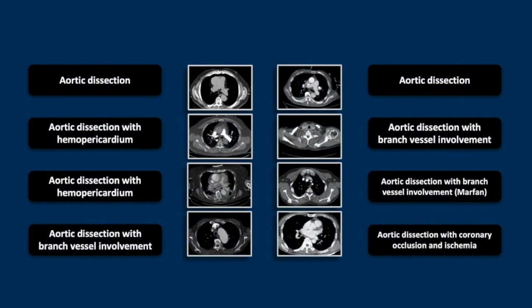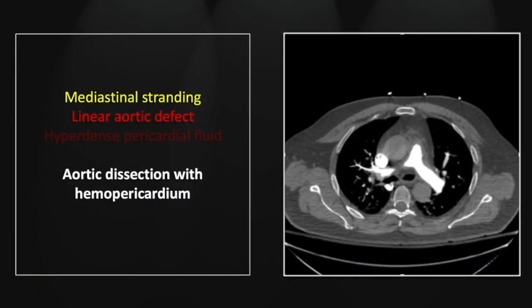Our next case is an aortic dissection with hemopericardium. This is a particularly difficult case, although your attention would be called to a great vessel abnormality by the presence of anterior mediastinal stranding. You can note a linear filling defect in the ascending aorta and the contrast differential there in the lumen. This study was done with pulmonary arterial emphasis, but in all patients with acute chest pain, aortic dissection must remain on your differential.